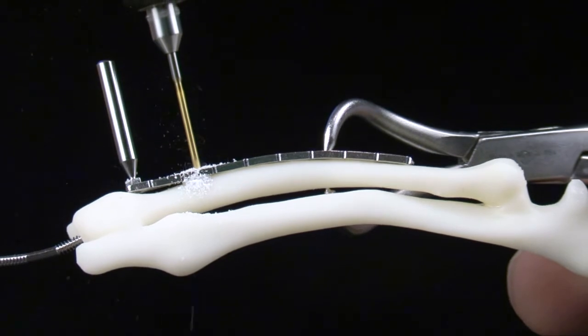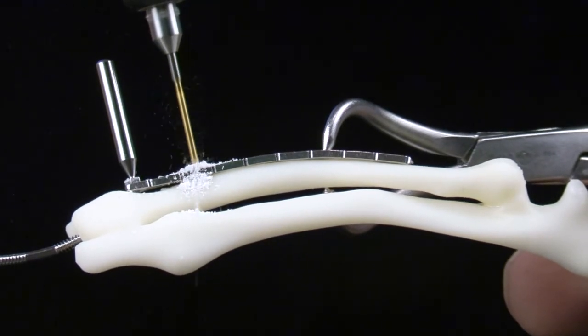Place 2 to 3 additional screws, verifying accurate anatomic reduction is maintained after each screw is inserted.